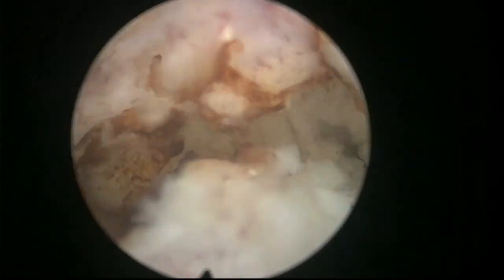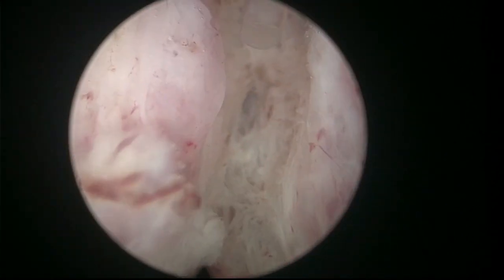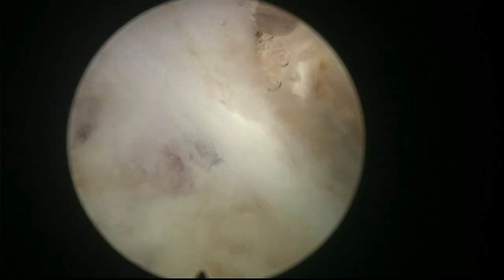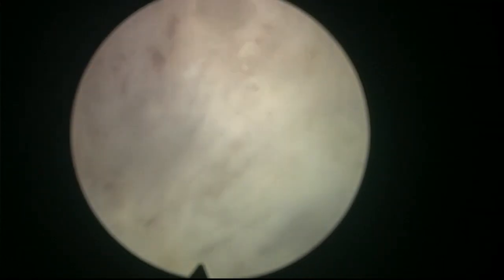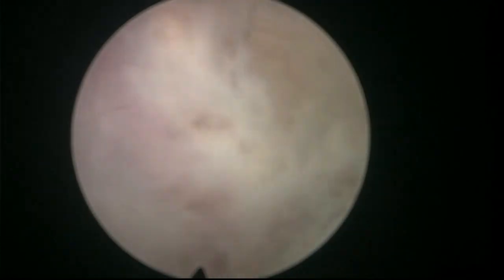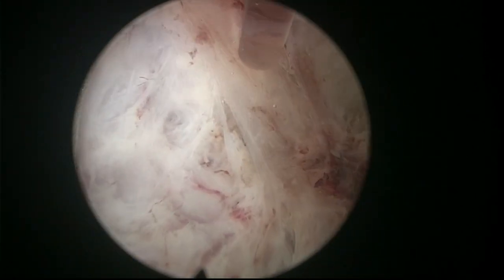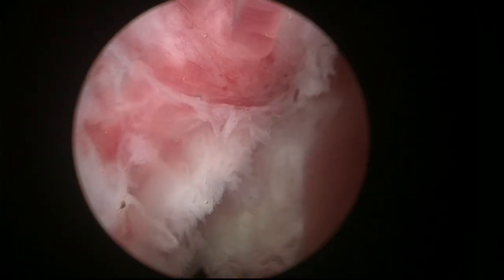Coming out at the 12 o'clock area. So we have been able to detach the lateral apex, let's say, from the sphincter. Coming all the way up to 12 o'clock. It's 12 o'clock fibers. Now I will concentrate on the other side of the apex.